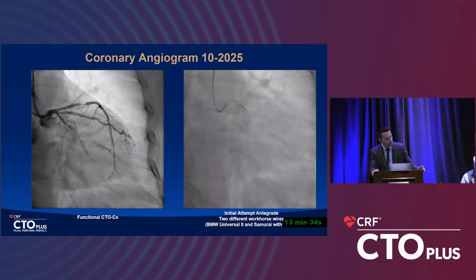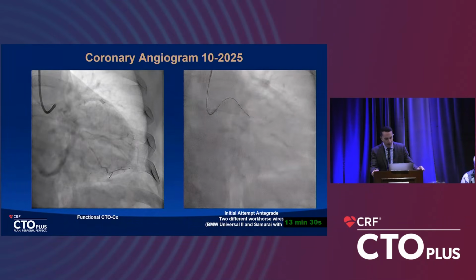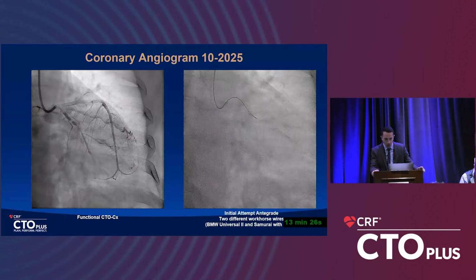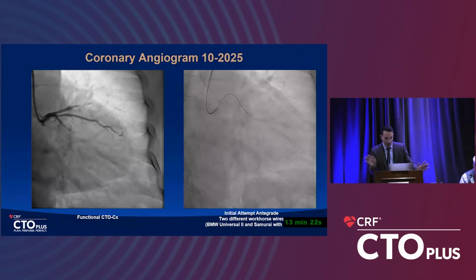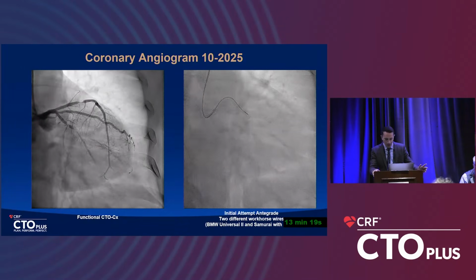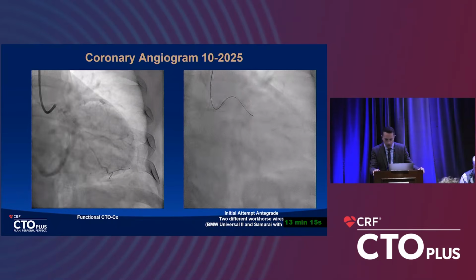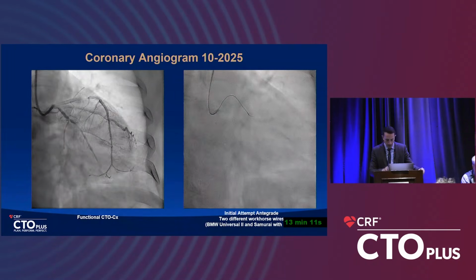This is one of my older colleagues from the generation who always taught us, be patient with your wire. I could do anything with my workhorse wire, I just need to be patient. The way I was trained is completely different. I was trained with Dimitri in New York, and the attention span was very short. If an equipment didn't work, you use a different equipment, and the better you know the properties of your equipment, the faster you get your cases done and safer.